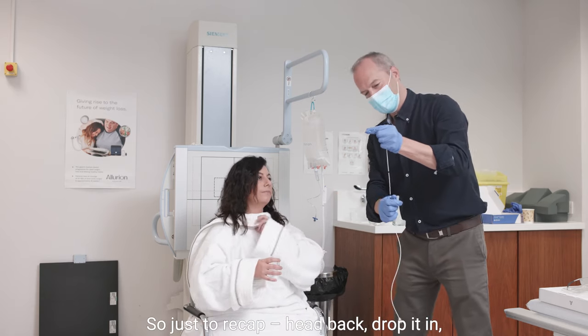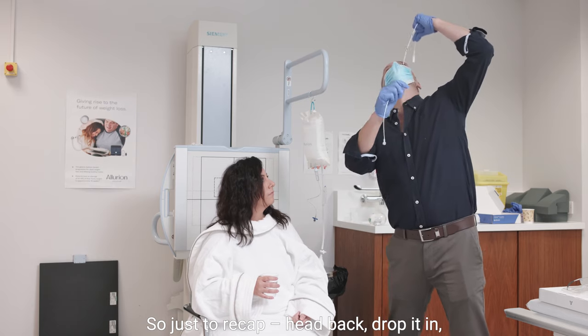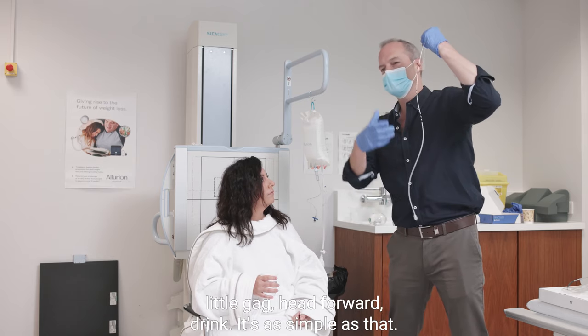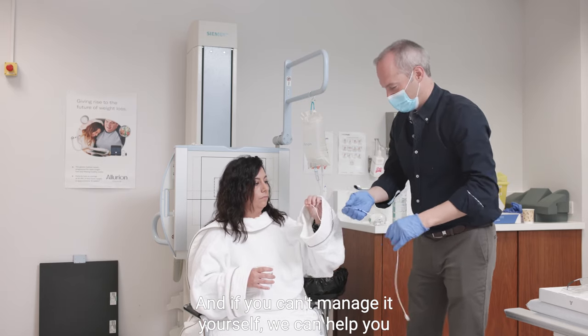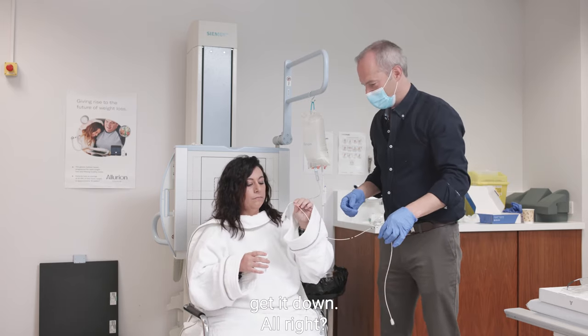So just to recap: head back, drop it in, little gag, head forward, drink. Simple as that. And if you can't manage it yourself, we can help you get it down. So just in your own time.